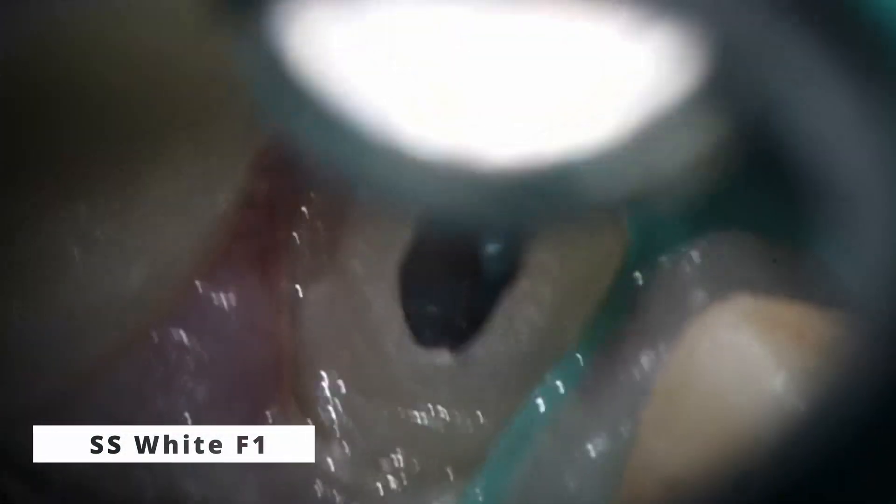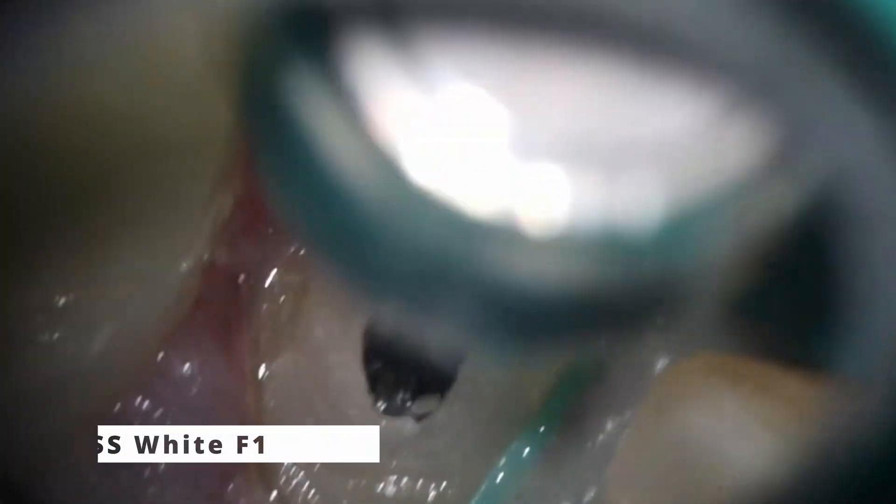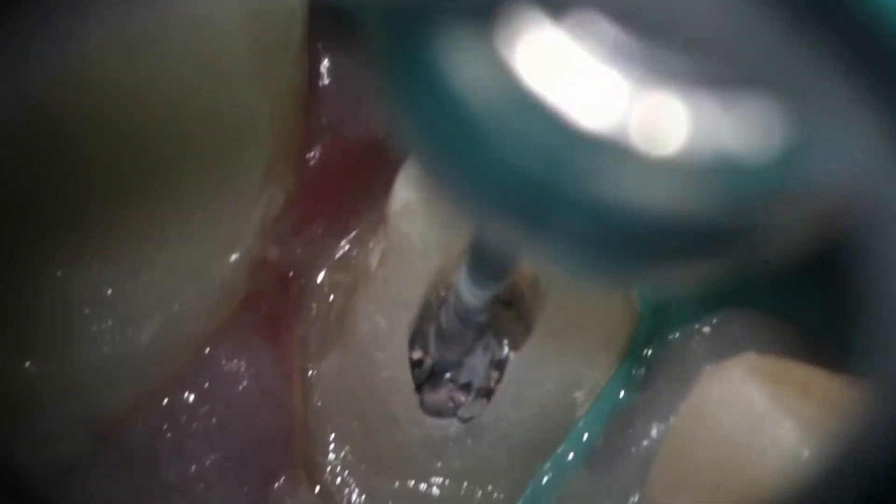If you're doing these, I highly recommend that you use a heated instrument to remove the bulk of the gutta percha. That way the post drill doesn't have to do as much, or just use the heated instrument to remove it entirely. What I'm doing here is taking an F1 and trying to remove as much gutta percha as possible. Unfortunately, you'll see in a second we snap off the F1 as well.